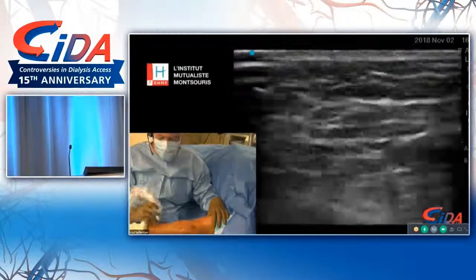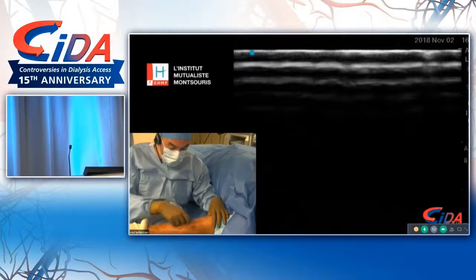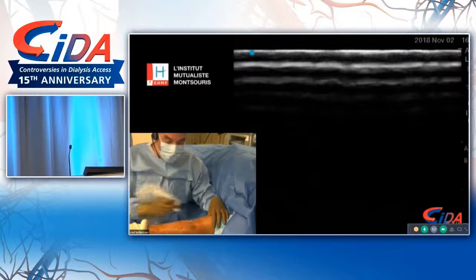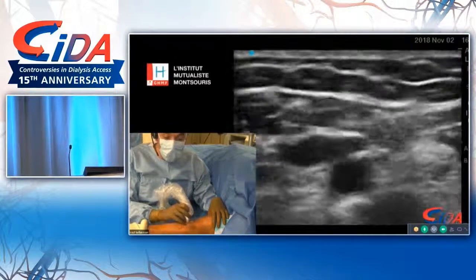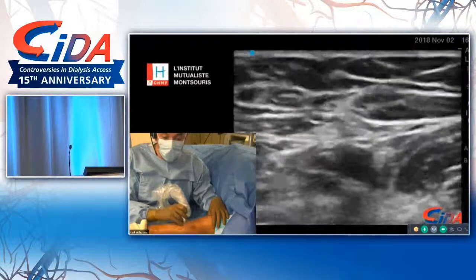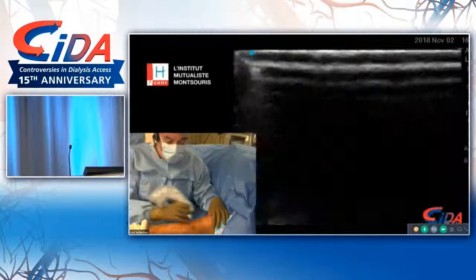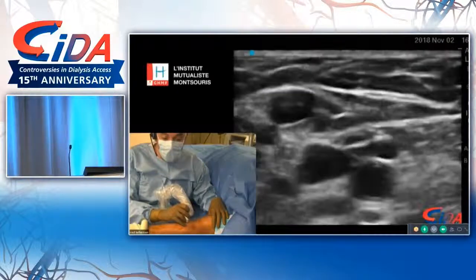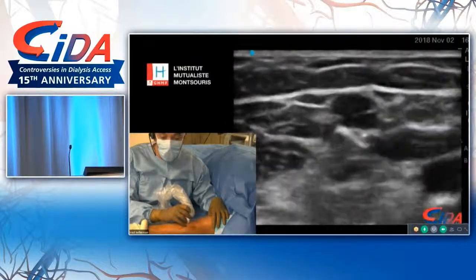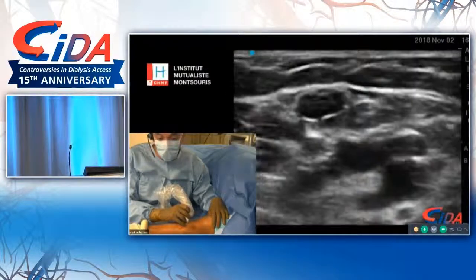So for these patients, as my mentor, Dr. Jennings, taught me when I was in my fellowship in Tulsa, I started doing the proximal radial artery fistulas because you're still in the radial and see how beautiful and normal this artery looks here in the proximal part, while in the more distal part it's calcified. And in this way, you have a larger vein, a better artery, and also the vessels are very close. The perforator and the radial artery are just side by side, so you can do surgical anastomosis.